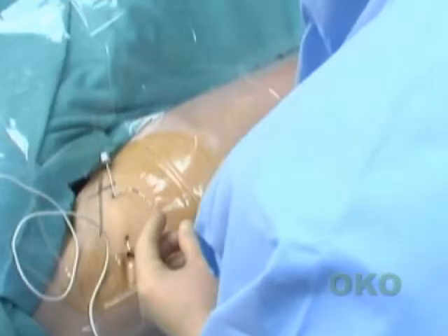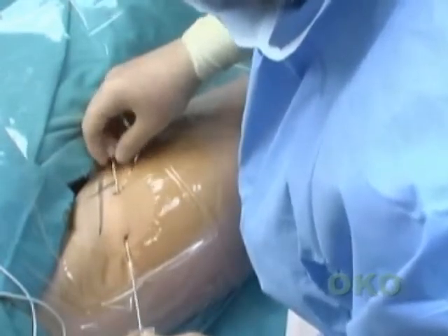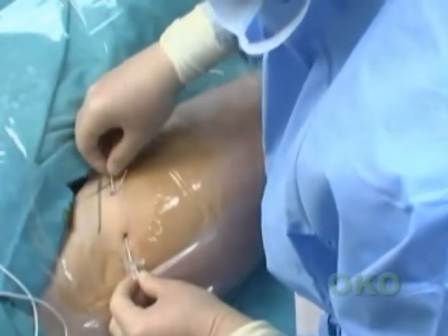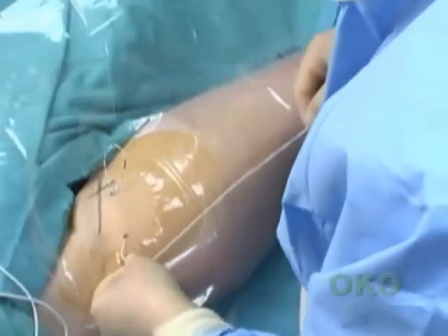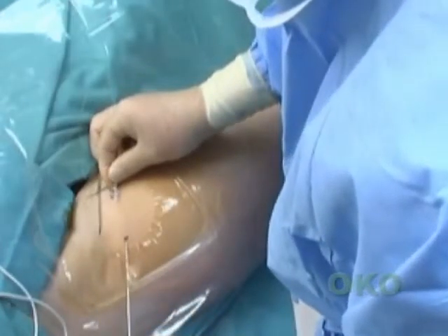The skin bridge will make removing of the catheter easier, but this has to be balanced against a higher frequency of leakage of the catheter. The needle is railroaded retrogradely over the stylet, the stylet is removed, and the catheter is fed through the needle and the needle removed. The piece of silicone tubing that protected the catheter tip while packaged is handy to place in the loop made by the catheter to protect the skin under the skin bridge.